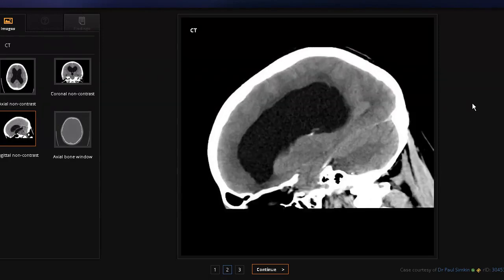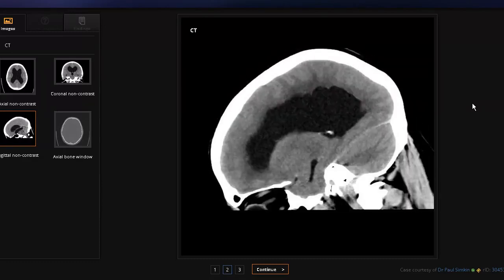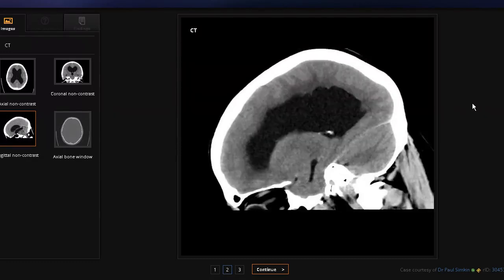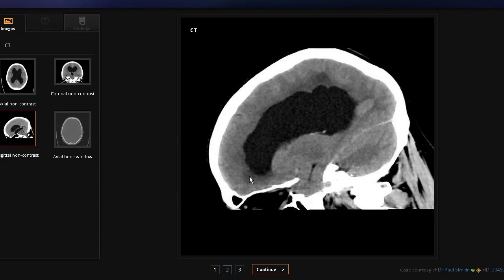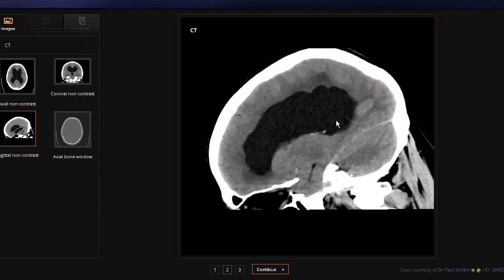The one in front of you is the sagittal section, where the person is divided into two halves — right and left. Starting from the top, here is the C-shaped lateral ventricle, and it is quite dilated. It had three parts: an anterior part, posterior, and an inferior part which enters into the temporal lobe. You can see how the inferior horn of the lateral ventricle is entering into the temporal lobe. This entirety of the lateral ventricle is dilated.